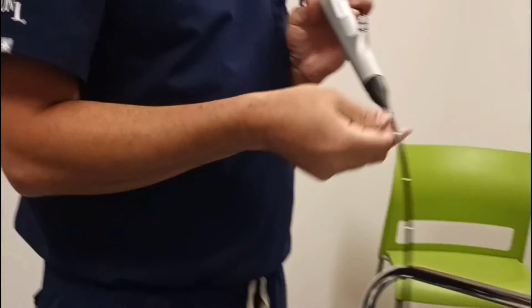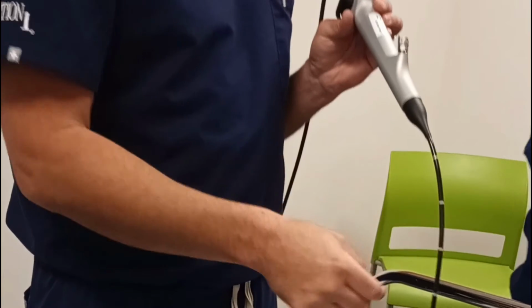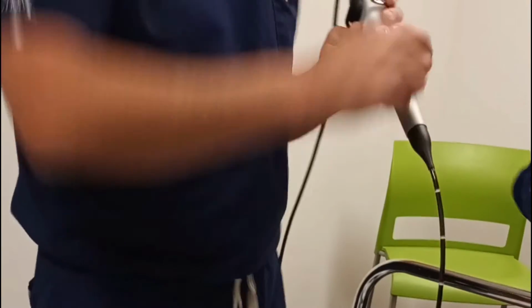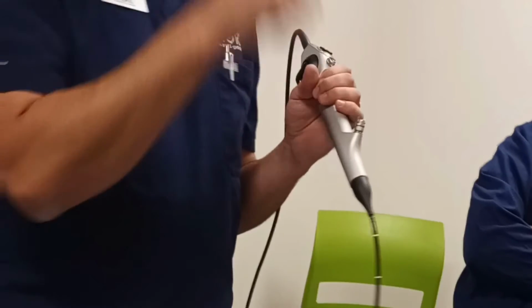Which one is the right way? Which one? I always recommend sticking it through, wiping it off, and then pulling it out. I'll pull it back up, and then once I pull it up, I'll wipe off the brush as well, and then I'll stick it back through.